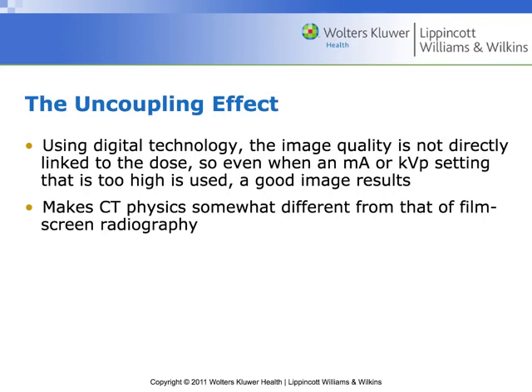One thing that she talks about is this uncoupling effect. She mentions it briefly in the textbook, and it's interesting because this is in contrast to film screen radiography. If you're not familiar with how film screen technique works, then this may not be as clear. So I'll try to clarify it to some degree here. Basically, for CT and for digital radiography, image quality is not directly linked to dose.